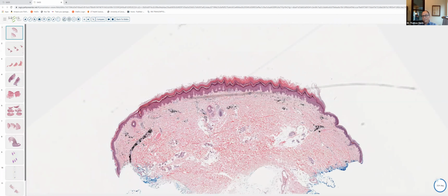Most of the times when we see hyaluronic acid in the skin, it's secondary. So a lot of times, you'll see an excision of a basal cell or biopsy of a rash, and there's pooled hyaluronic acid at the base of the specimen. And usually if you call the clinician, they'll say, oh yeah, the patient had Restylane. So in most instances, it seems to be an incidental finding. Okay, let's go ahead and move on to 11.